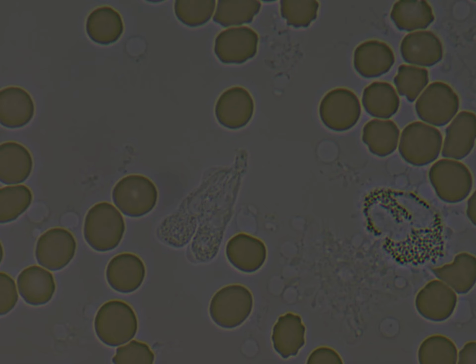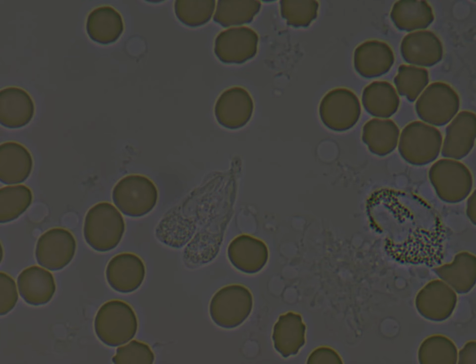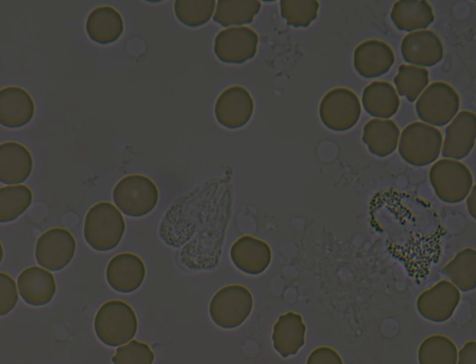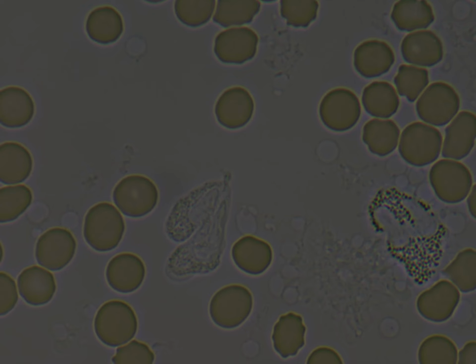Eosinophil has a lot of very toxic proteins that attack the cell membrane of multicellular microorganisms, and as a result the multicellular microorganism dies and is phagocytized by the neutrophils or by the eosinophil, but mainly by the neutrophil.